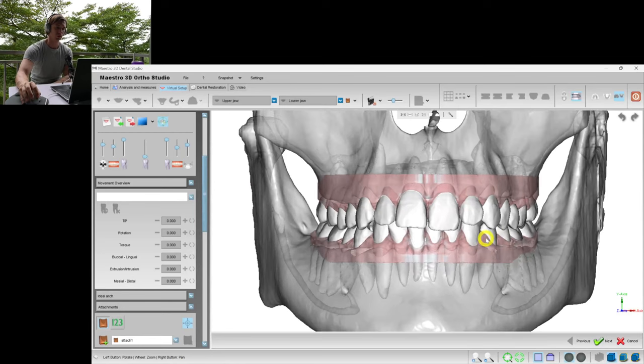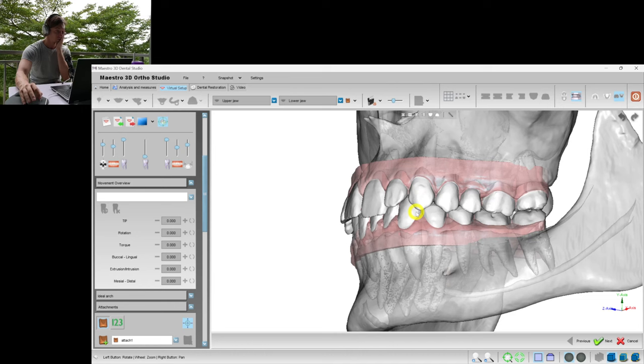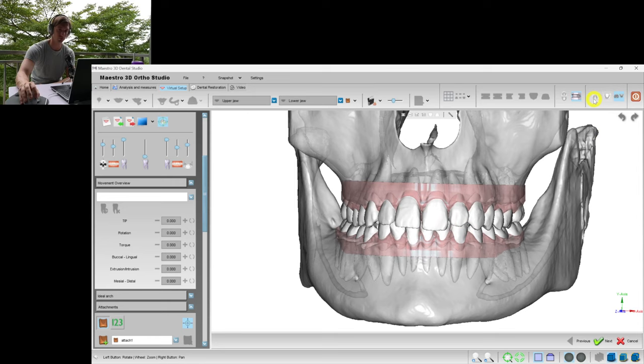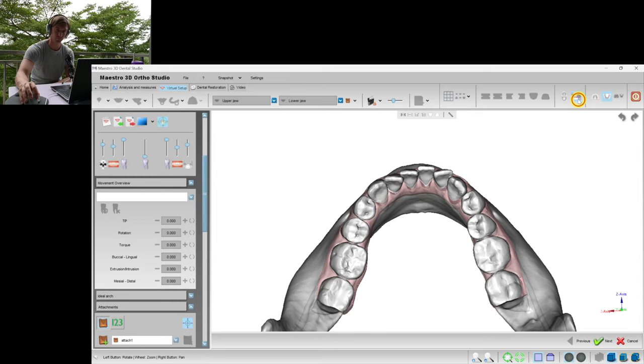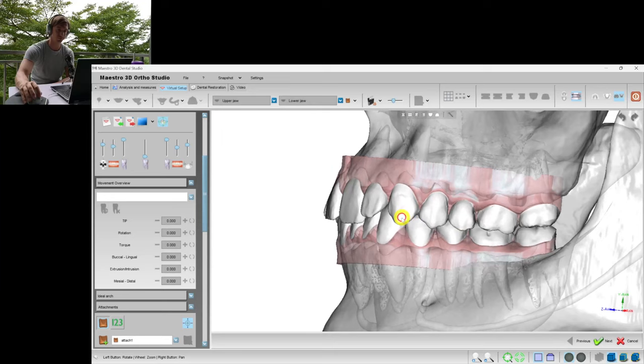We're recording the process of creation of the virtual setup in Maestro 3D version 4. The chief complaints are crowding on the upper and lower arches. The doctor also wants me to improve the depth of the bite and improve the occlusal contacts. Let's see what we can do.